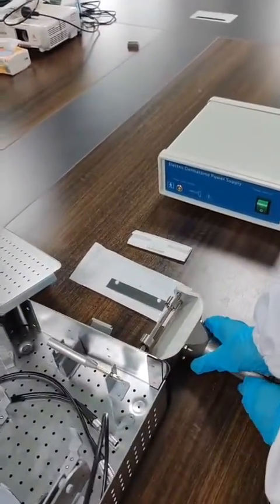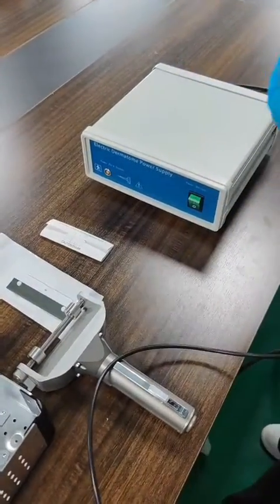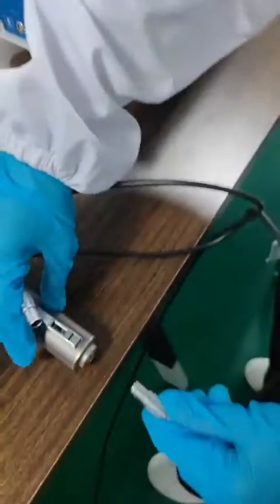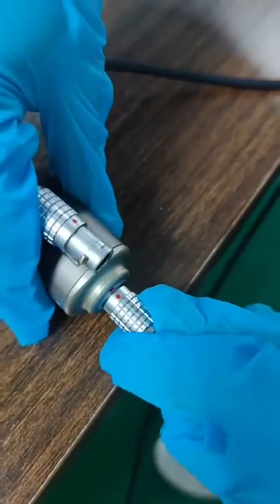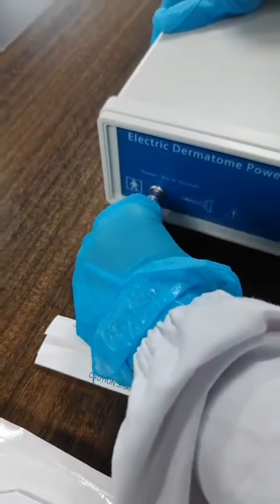Now take out the handpiece. Point to point, connect the handpiece to the power supply. Hold this part, please. Align the red point.